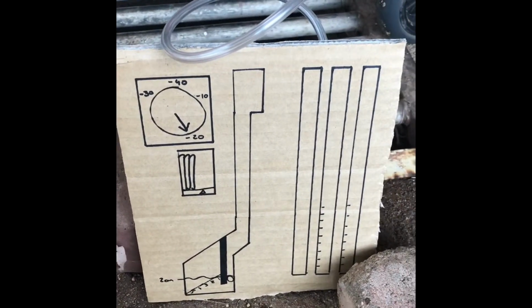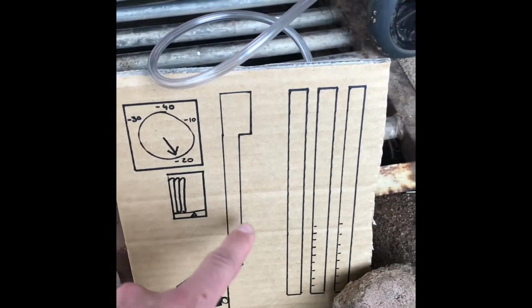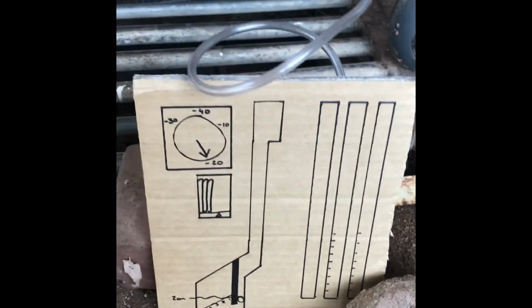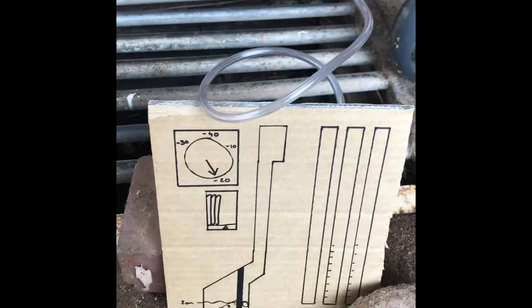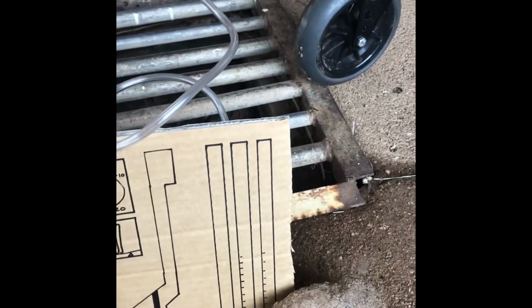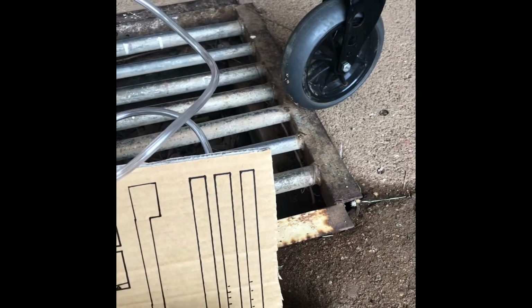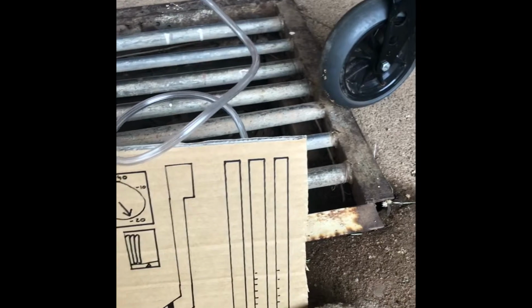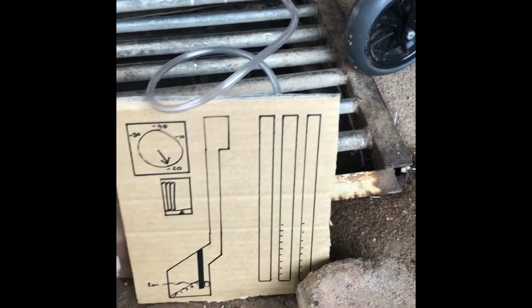During the respiratory cycle, we might observe a swing. The ball will come up the chamber there. If we're not observing a swing, it's either a block in the tubing or the patient's lung is fully re-expanded. We're going to note the quality and amount of fluid coming out of the drain, and we'll mark it off as we go, with the time. Anything over 100 to 200 mils in an hour is deemed significant.